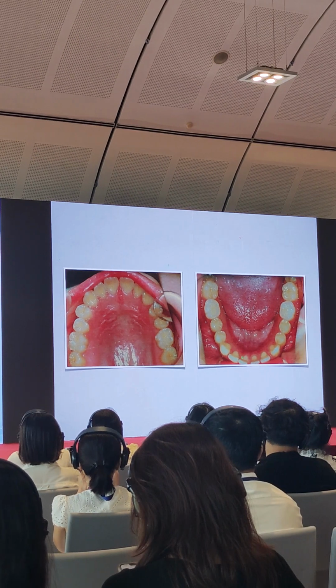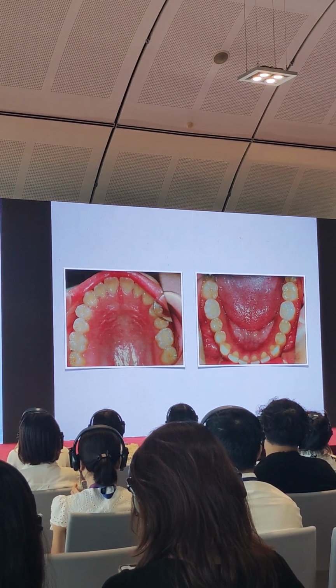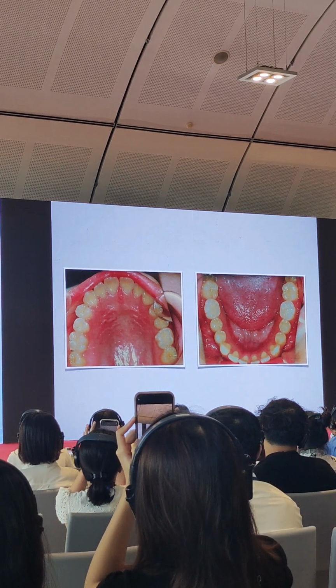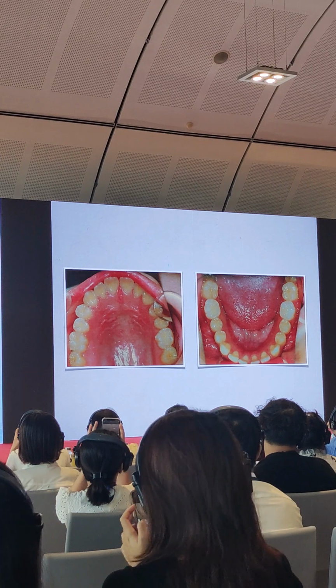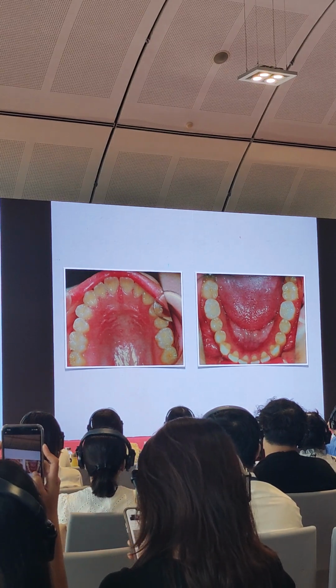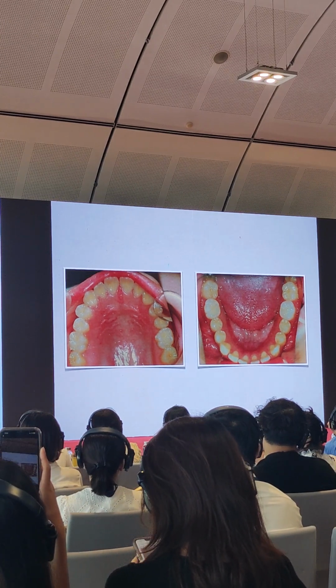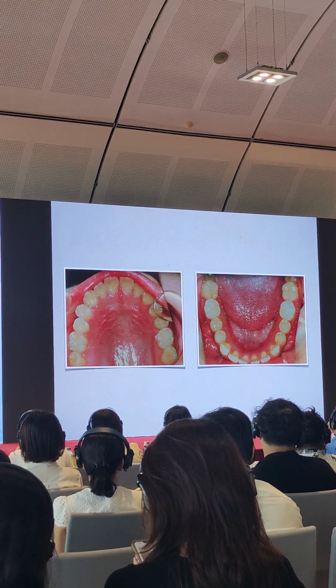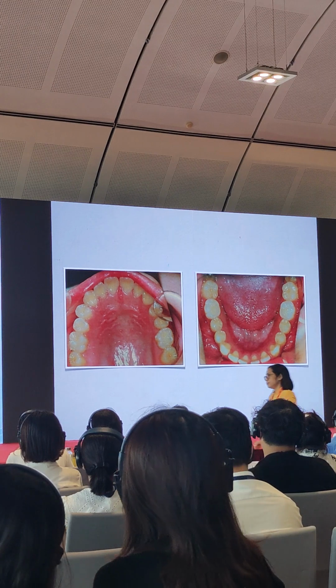That's why it has a lot of diastema on the lower. The diastema can give us an advantage when we are doing class 3 cases because it can help us do a little bit of retraction. Then you don't need to move the mandible more backward because you have already reduced the underbite of the patient.